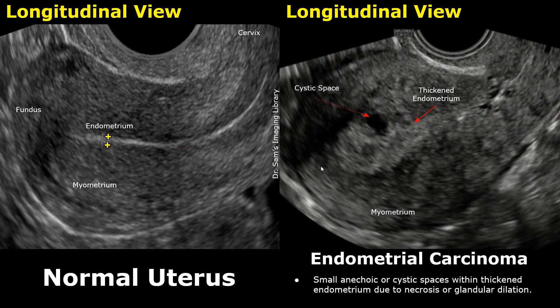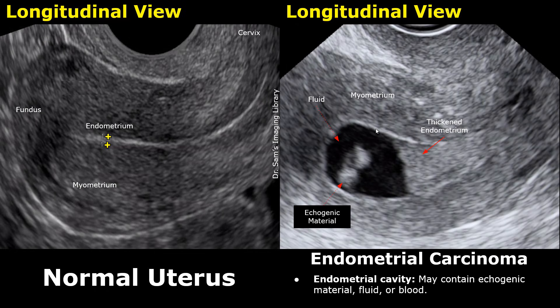In some cases, you may find anechoic cystic areas within the thickened endometrium due to necrosis or glandular dilation. You may also find a collection of anechoic fluid with echogenic material. This is the thickened endometrium, and this is the anechoic fluid with echogenic areas, which can be fluid or blood.